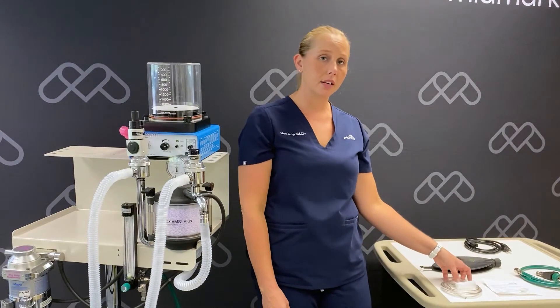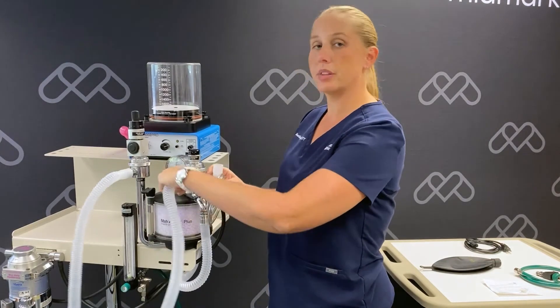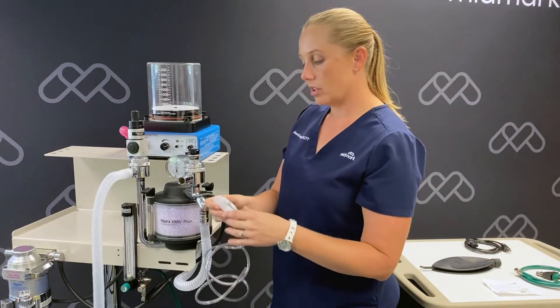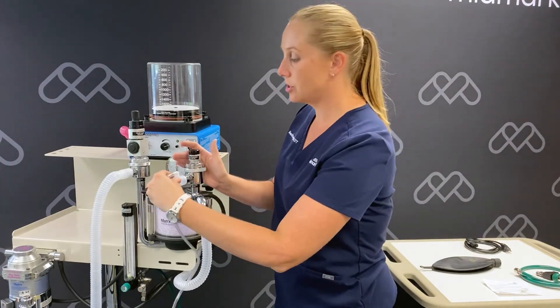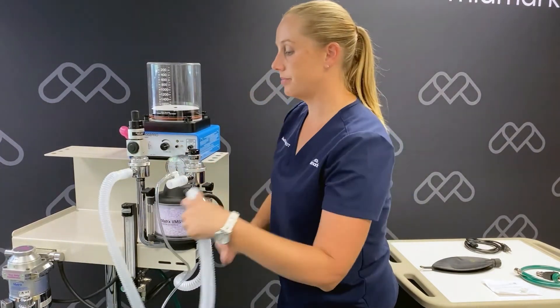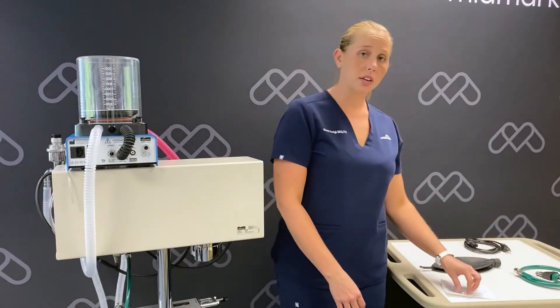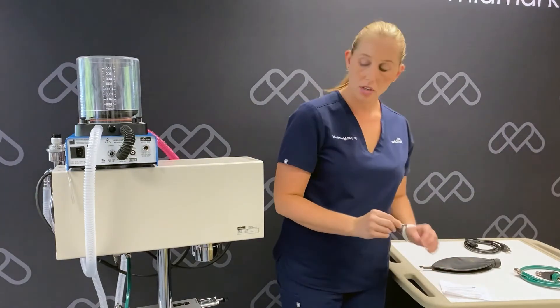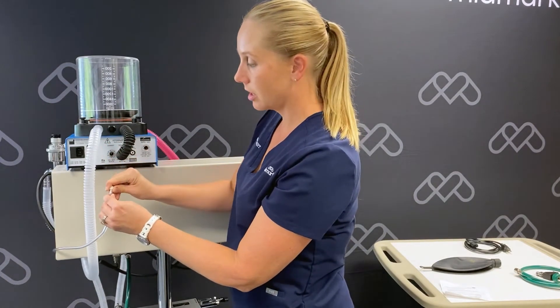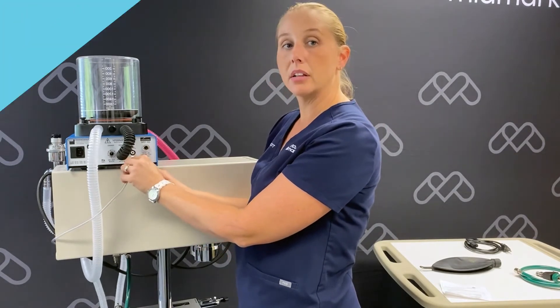Our next component we're going to add is the airway pressure sampling T. We'll start by removing the patient breathing circuit from our inhalation arm of our anesthesia machine. We'll push the sampling T onto the inhalation valve and reattach our patient breathing circuit. There is a luer lock fitting that came with your pressure sampling T. You're going to push that with the barbed end onto the end of the clear tubing. Once that's installed, you will attach that to the pressure transducer port on the back of the ventilator.